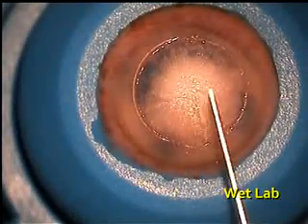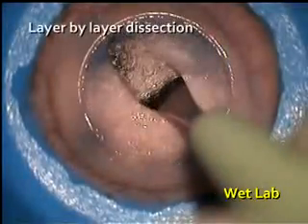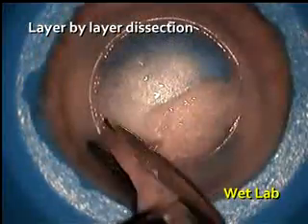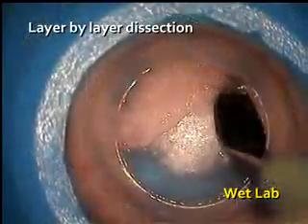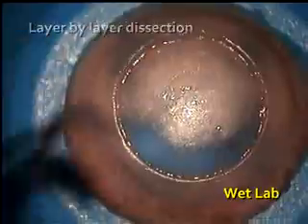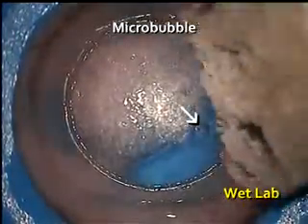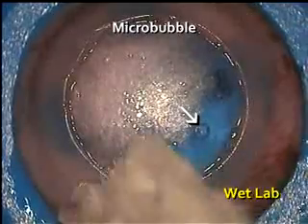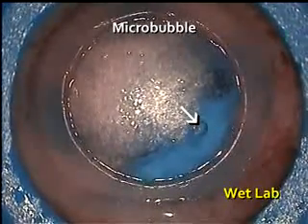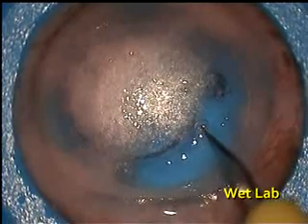So we went back to the wet lab to see whether it really works. Picked the failed bubble cornea. Layer by layer dissection was carried out. Microbubble nearest to Descemet identified. Punctured.